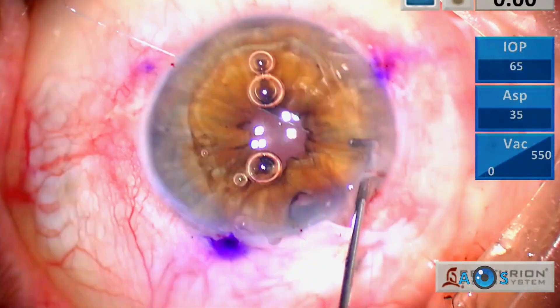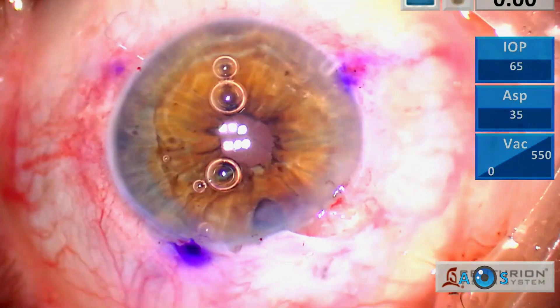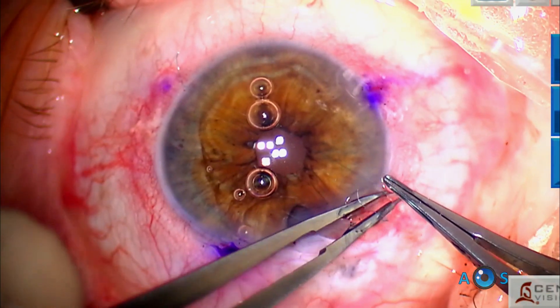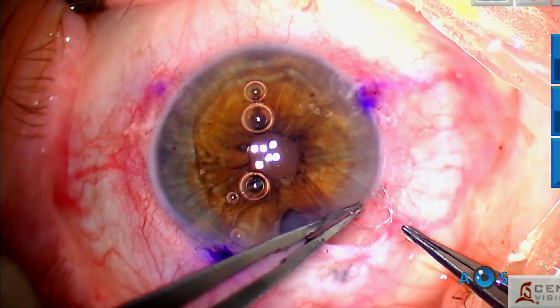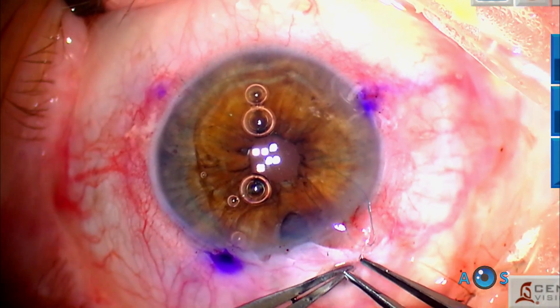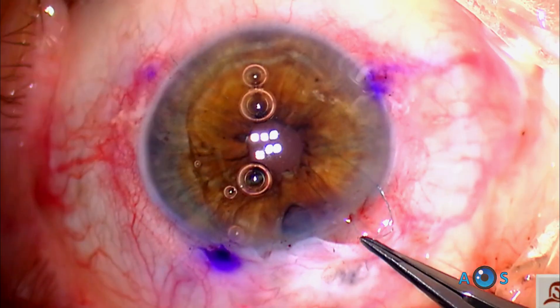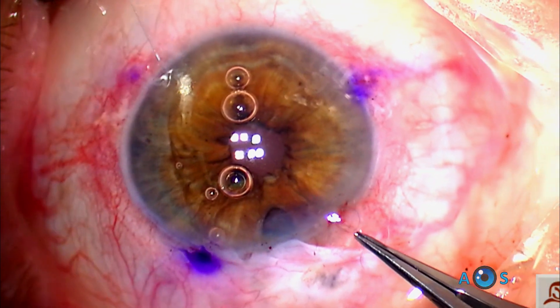Finally, the third and final knot is given — this time a Siepser sliding knot is employed. The distal thread is partially retrieved forming a loop, then the proximal thread encircles this distal loop two times. The threads are then pulled through the opposite paracentesis and the knot slides and is locked in place.